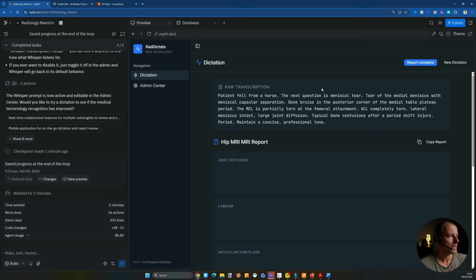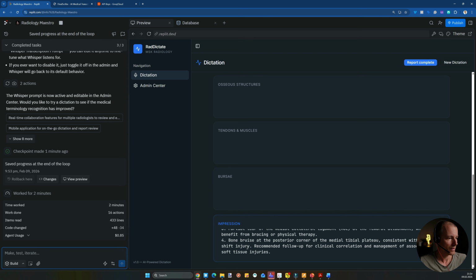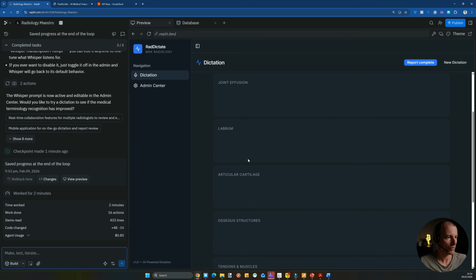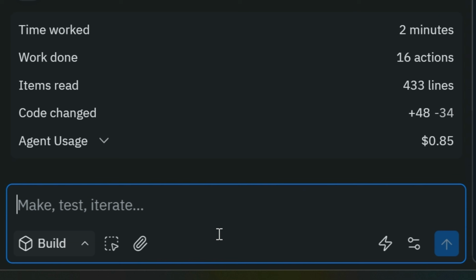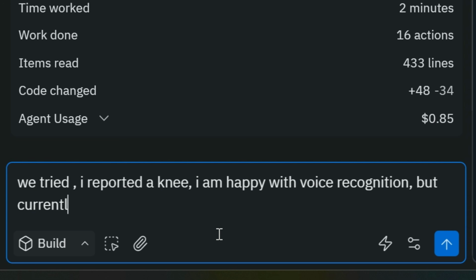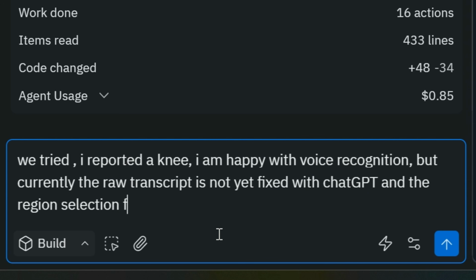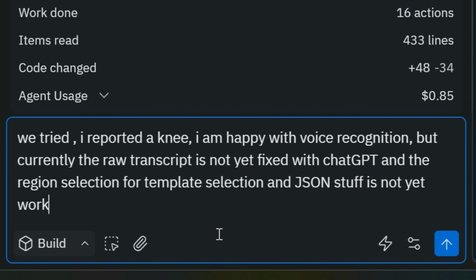So what should happen next with the raw transcript is basically, the process is not correct yet. We can see an impression, but this is obviously rubbish. It's using a hip template. So we tried, I reported a knee. I am happy with voice recognition, but currently the raw transcript is not yet fixed with ChatGPT, and the region selection for template selection and JSON stuff is not yet working.